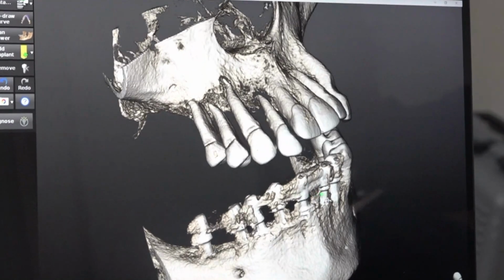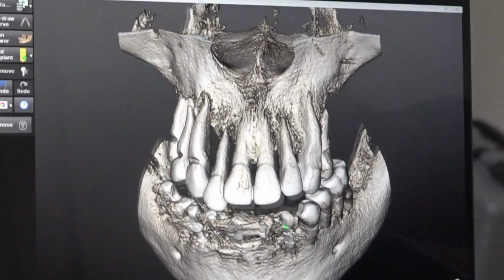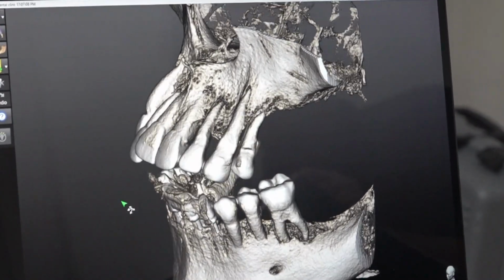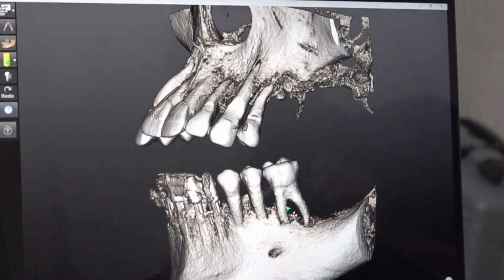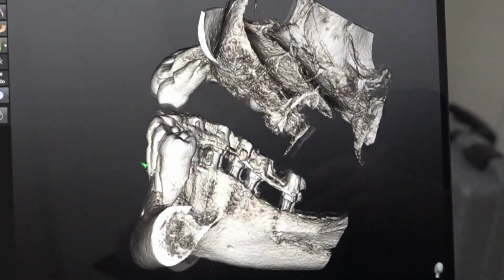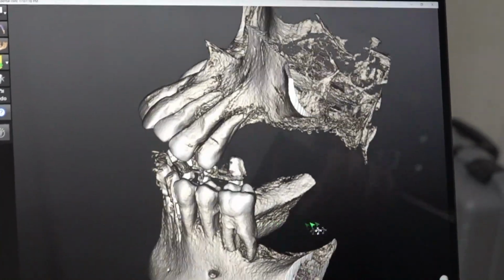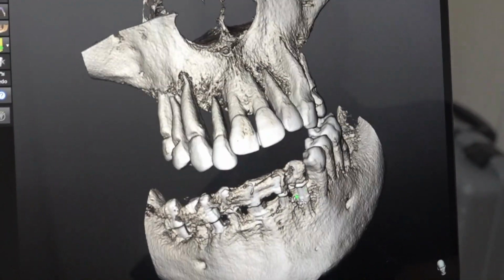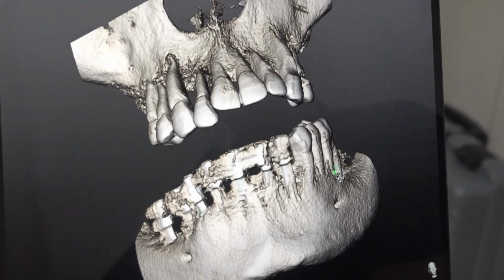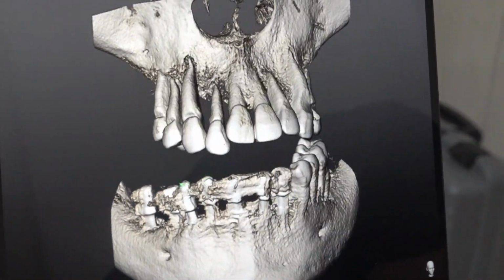Start. For this patient, we have already done lower implants, not full, but almost full. Only 2 premolars and a molar are present. They are also not very good. Maybe 1 year back we did. When we did? Below. More than 1 year. Usually we won't do like this because the patient is having only anterior chewing.